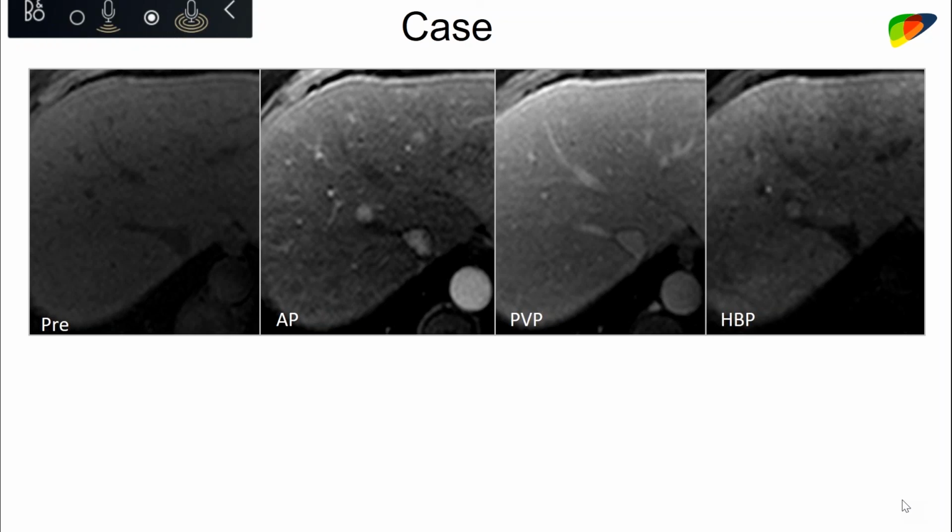I'm just curious how Bill and Victoria would handle such a lesion. Maybe Bill, could you answer that first, and then we can ask Victoria what she would do with that? I agree. I would handle it the same way. I would consider it LI-RADS 2. If it was a solitary nodule, I might mention it in the body of the report. If there are many of them, maybe I wouldn't, but I probably would not make it into the impression. That would be my pattern there.